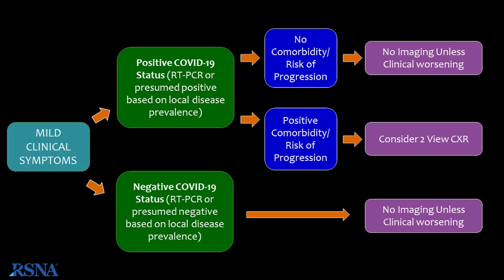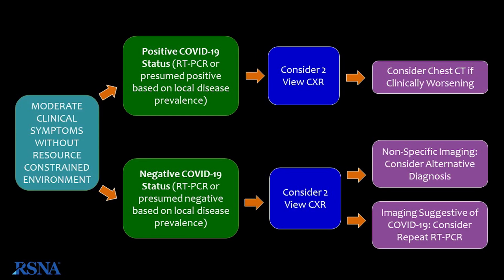deterioration. However, in the COVID positive group, with patients who have underlying comorbid medical conditions that place them at risk for progression, a 2-view chest radiograph should be considered.